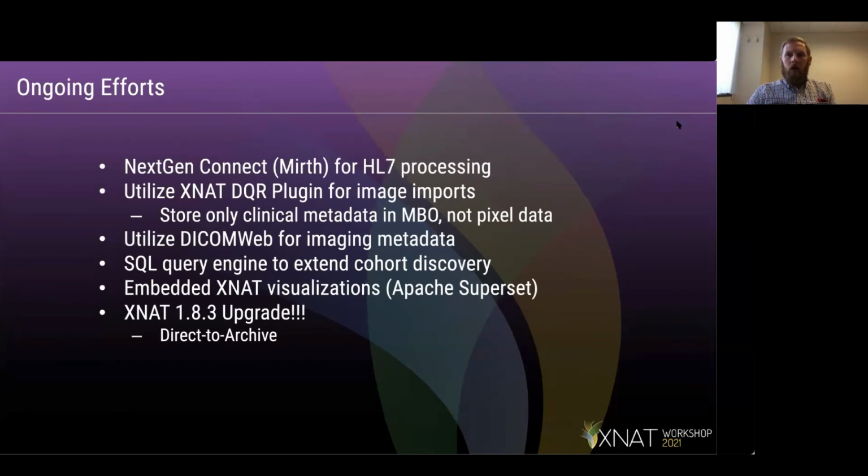Some of our ongoing efforts on the HL7 front: we want to add in a Mirth Connect, or NextGen Connect, previously known as Mirth server, which will allow us to take these messages in from the hospital and send them to multiple databases if we want. So directly to XNAT will be one place that we take the reports in. And then again, excited about DQR.